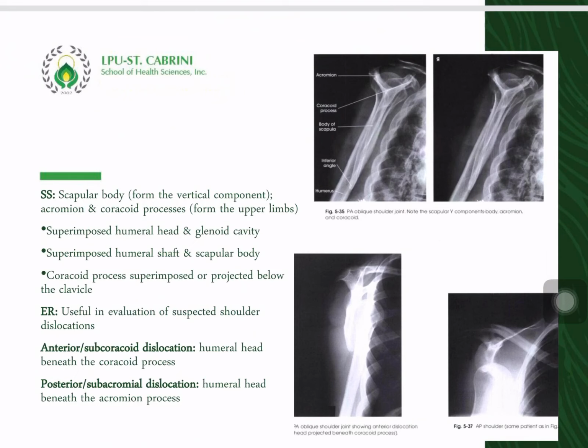These are the projections for the shoulder joint, and in the next recorded lecture, we will learn the projections for the glenoid cavity. Please prepare for a short seat work on Friday, October 29, regarding the shoulder joint projections.